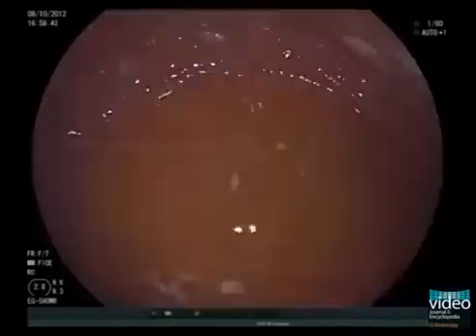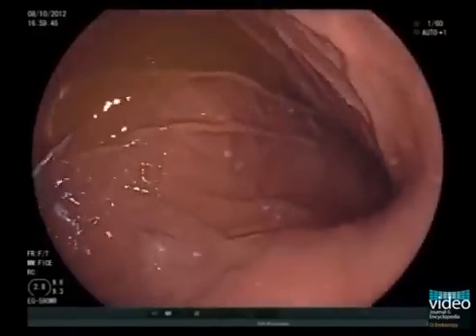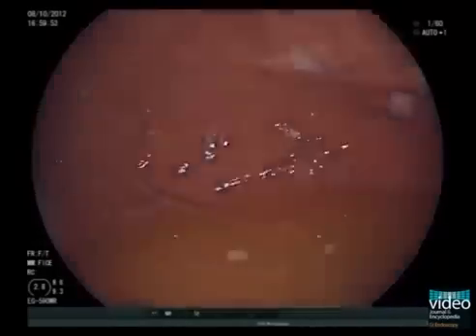Once the upper gastric body is reached, we prepare examination of the cardia and fundic area by means of retroflexion. Deflect the tip upward and insert the endoscope blindly until the cardia and fundus are seen.